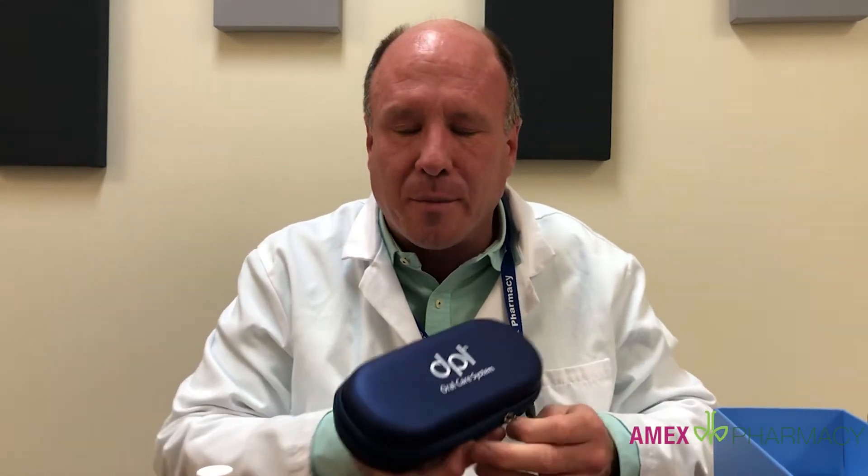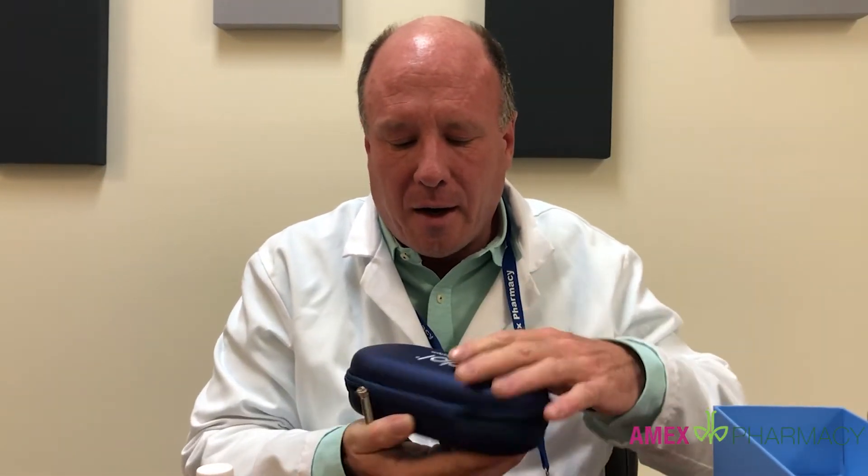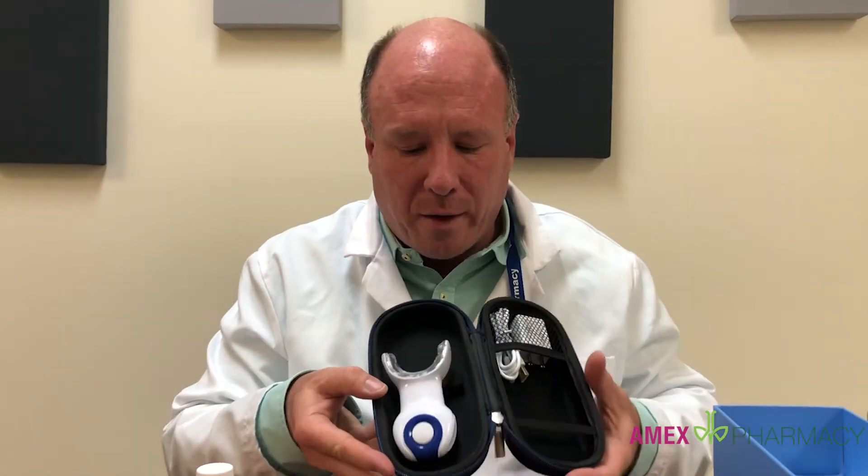The light device comes from a company called DPL and it is designed for orthodontic and photodynamic therapy for gingivitis and other things. It's a non-prescription item. It's very nice and here's what it looks like.